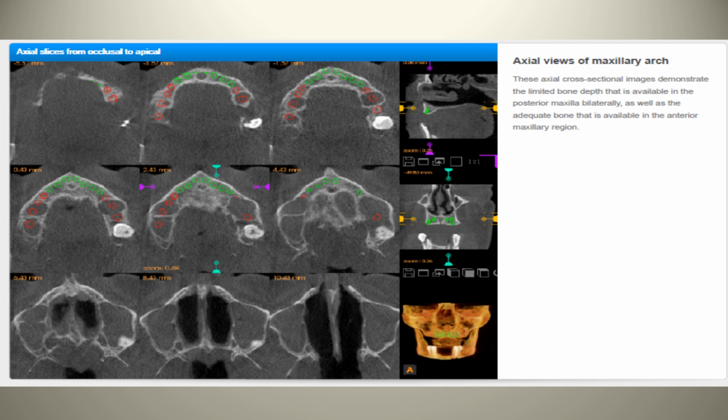A lot of these scan facilities like Canarray actually provide you with some sort of software which you can download and use. And when I'm telling you that these things are available off-site, what I'm trying to tell you is that we do not have a cone beam CT scanner in our facility. Now some people say that this is the standard of care, that every facility should have one. I think the only people saying it's the standard of care are the guys who are selling it. So if you are not doing a lot of CT scans, or you don't have a lot of cases where a CT scan is required, and the key word is that it's required, you have to consider whether it's something you need to add into your own office.